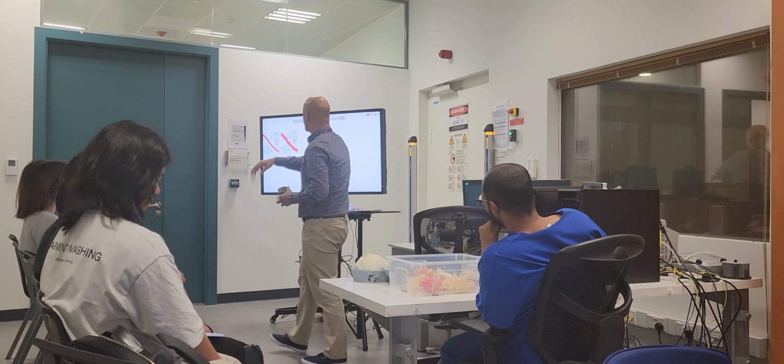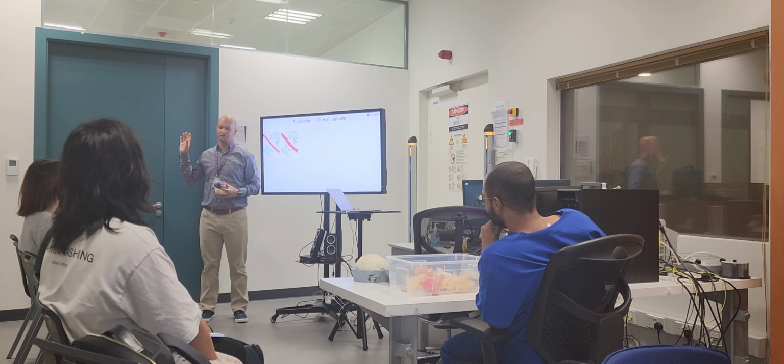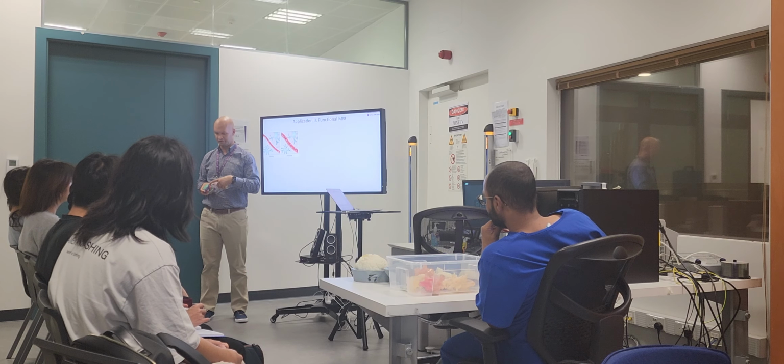But what happens when I do this for 20 seconds and then I do this for 20 seconds. I do this for 20 seconds. I do this for 20 seconds. Because it's my right hand, here is my hand now on the left side of the brain. So my right hand now, this is the blue thing, is the motor cortex. This is the hand area. Okay. So this is the hand area that controls my hand.